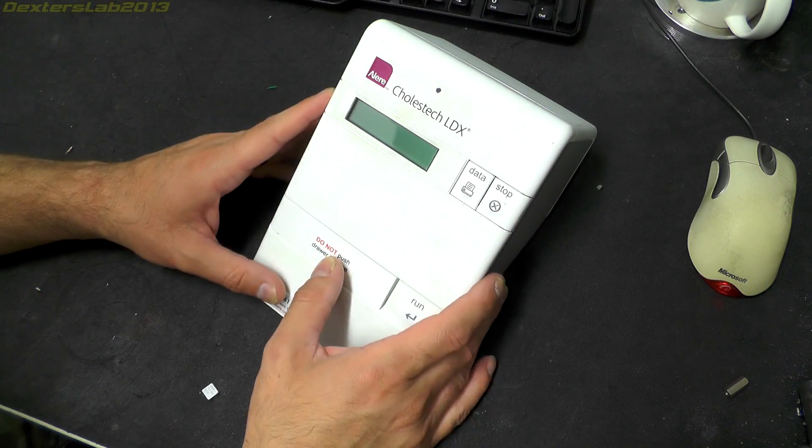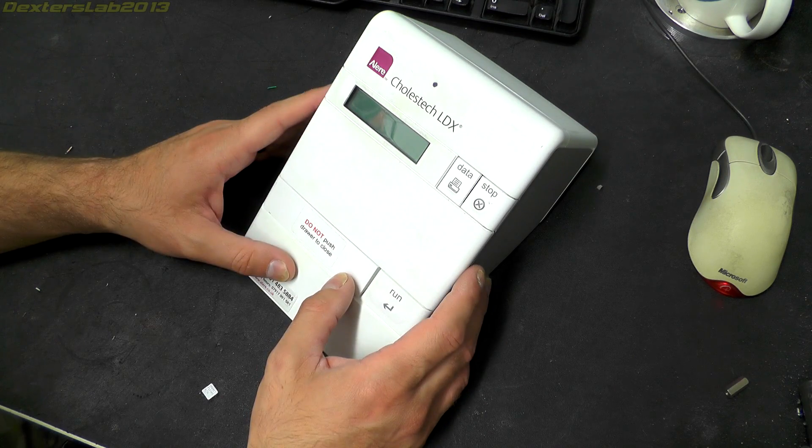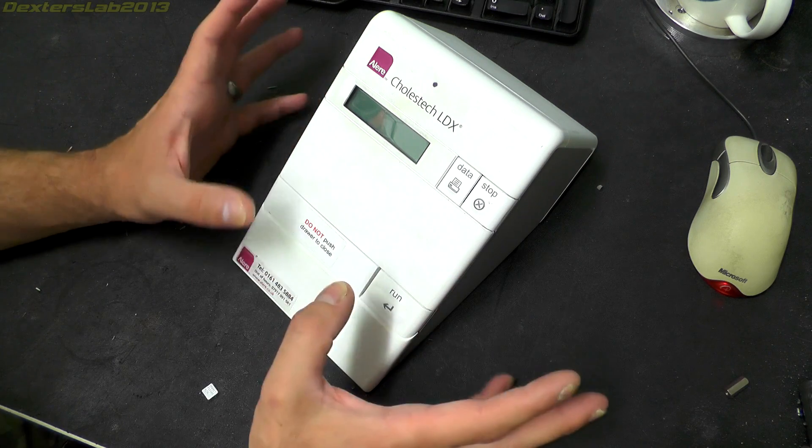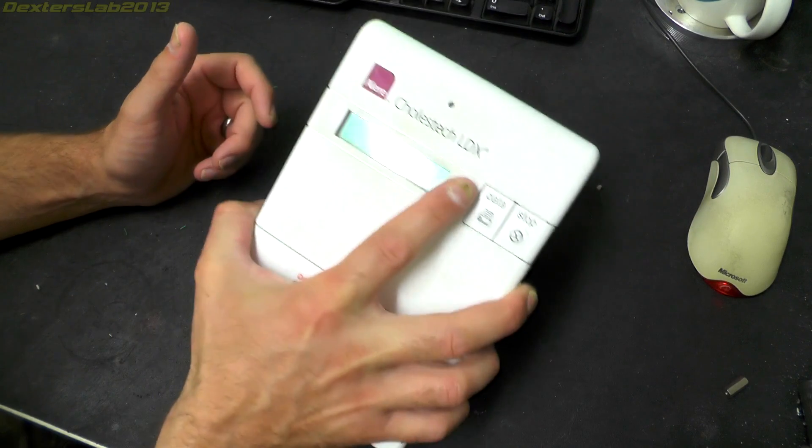Hello viewers, time for another teardown. After the humongous CR500 Kodak reader that I took apart last time, I decided to go for something a little lighter. This certainly weighs less than a kilo.